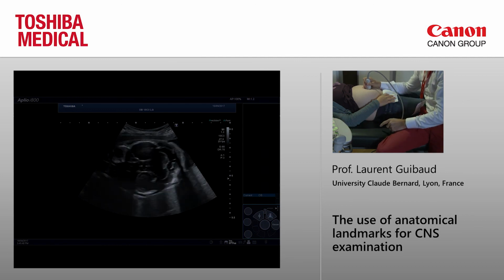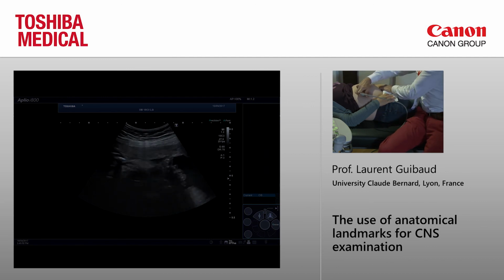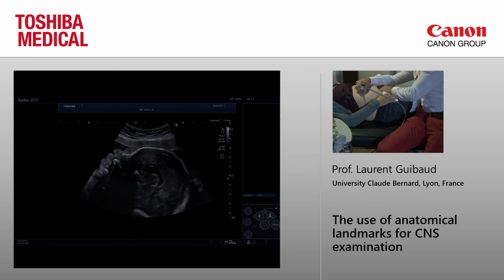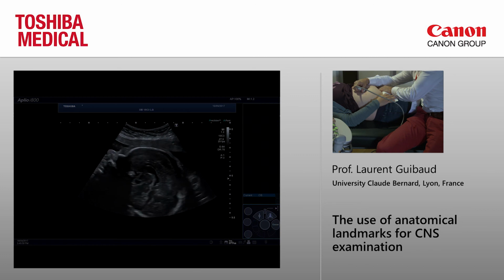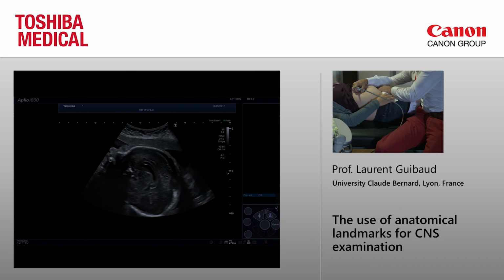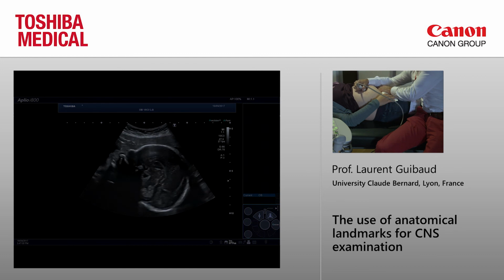Okay, you see clearly the fourth ventricle here. You see also the optic chiasma here and the optic nerve, and we have to have a look at the midline. I try to have a good view. Okay. Not too bad. This is better.